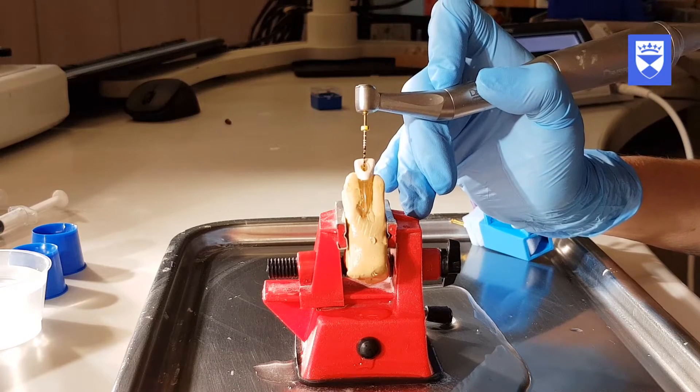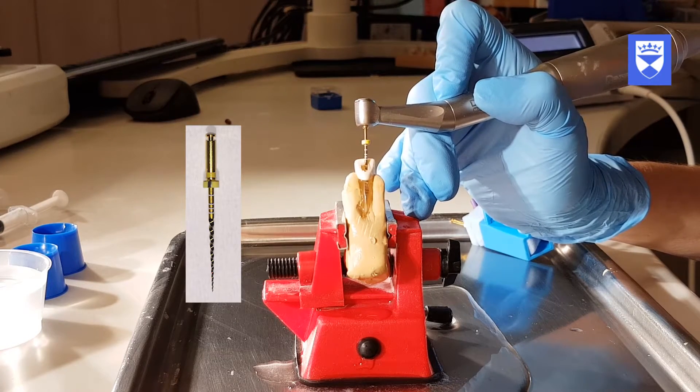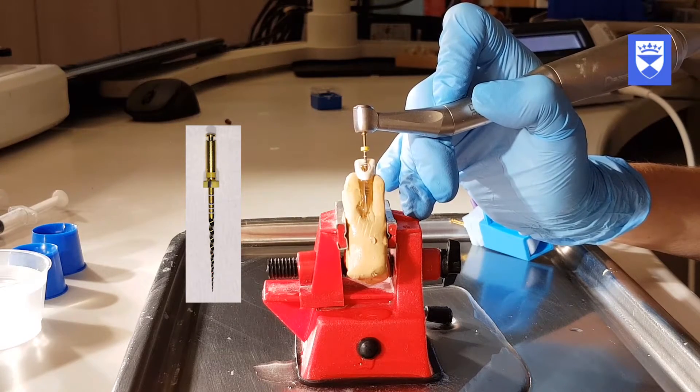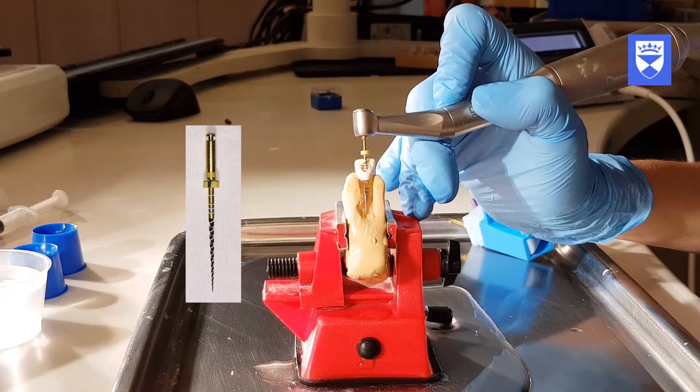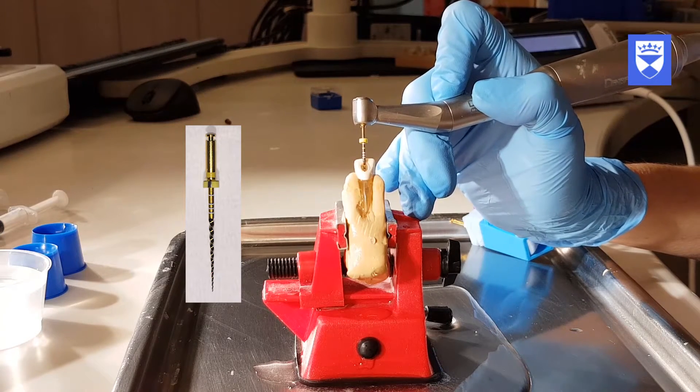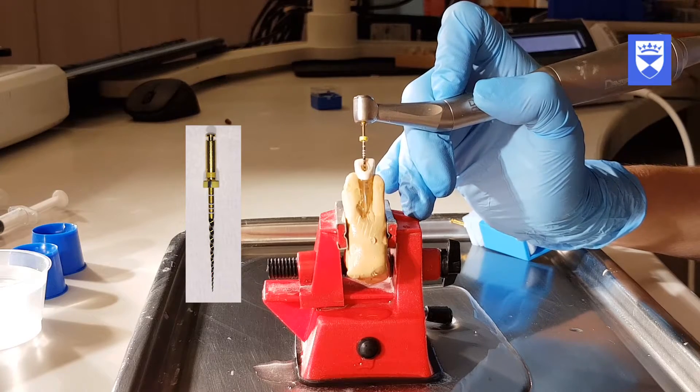Starting with the smallest file, F1, the file is used briefly in the canal with no brushing movements. The canal is irrigated, recapitulated with a size 10 flexofile and irrigated again.